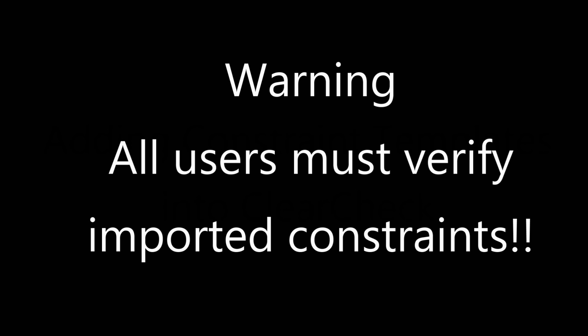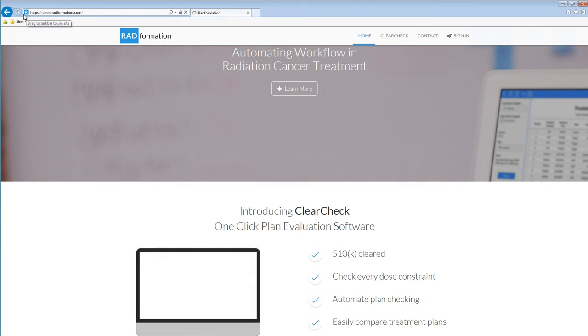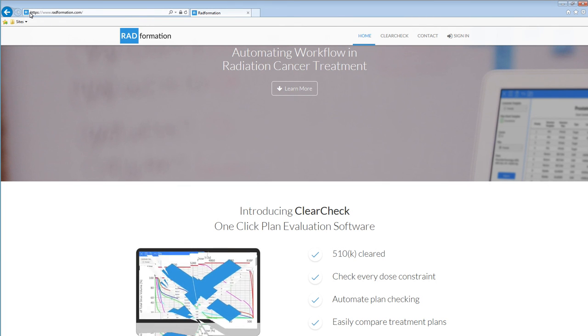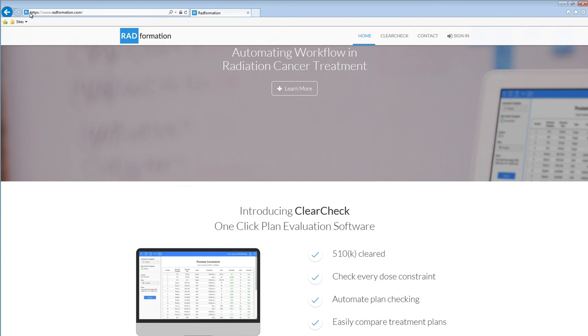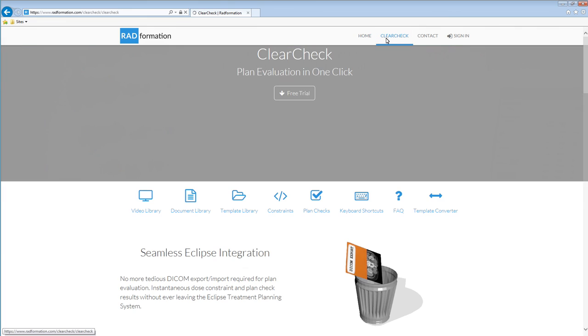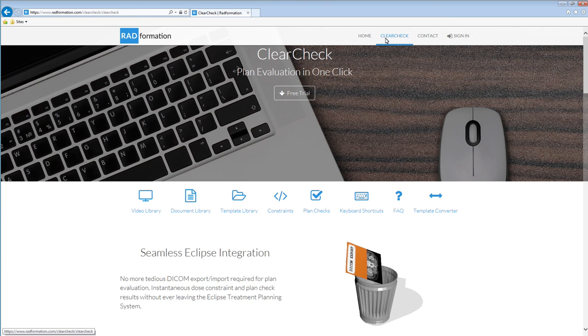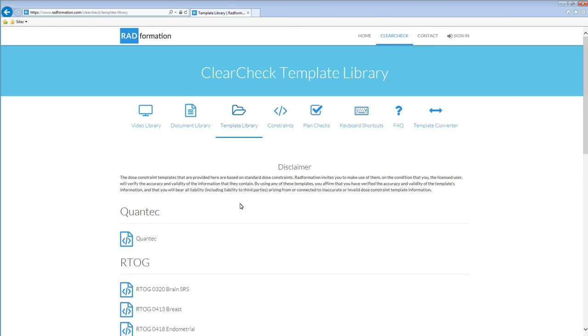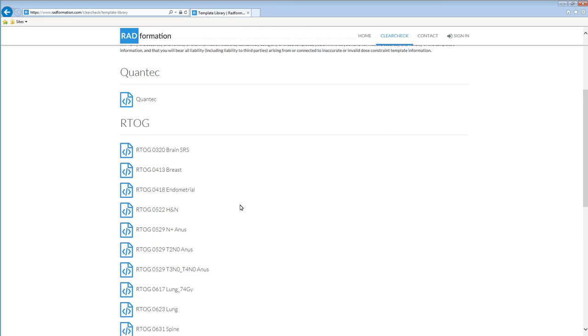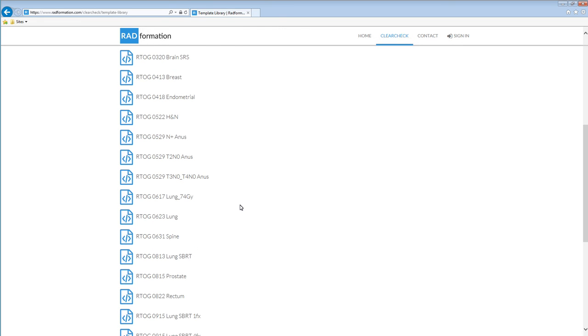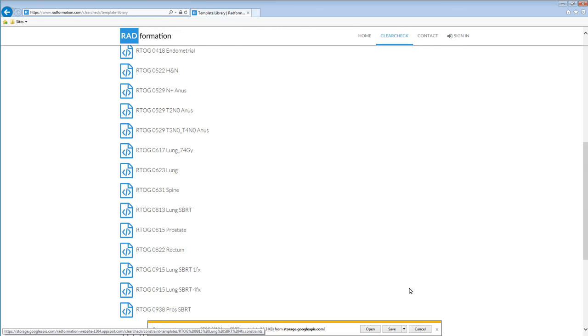Finally, I'm going to quickly show you how to pull in the 0813 lung SBRT protocol from our website. This has all the constraints and tables pre-built for your convenience. It is the end user's responsibility to verify the validity of these constraints whenever importing constraints into ClearCheck. First, go to radformation.com, look for ClearCheck. Next look for the template library link and then look for RTOG 0813 lung SBRT template. Click it and download it.